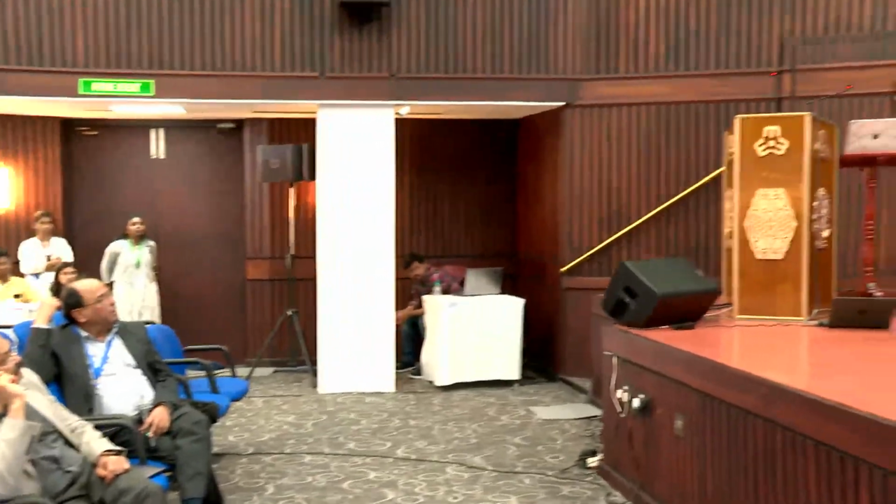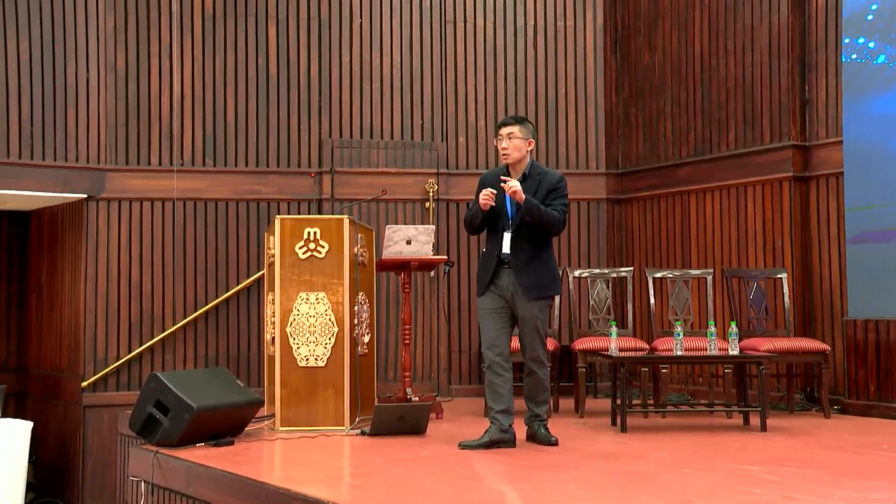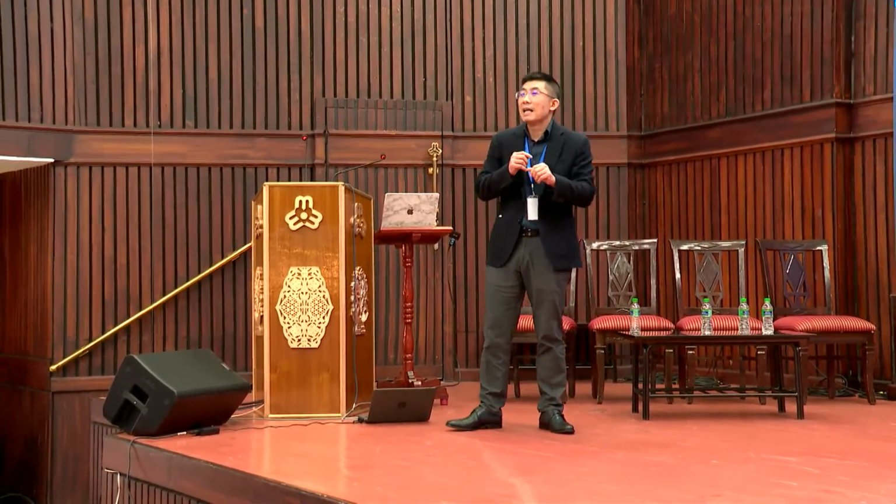Okay, so the answer is yes, you should, on your LV. The QLV still works. No, I'm not asking about QLV. I'm saying, do you have a choice where you will put your DF lead in the RV? What location? Because you want free wall pacing to synchronize the best, and of course in the RV you can't do free wall pacing. I don't have a good answer for that other than a more pragmatic one: if you have a small heart, go into the apex and make sure the coil is in the RV, that's it.